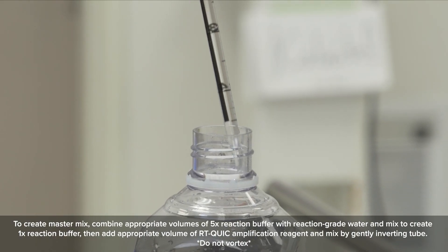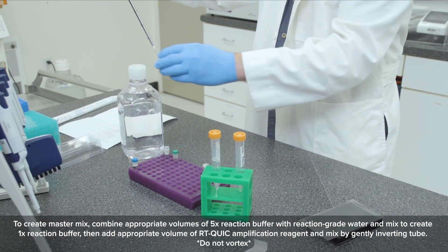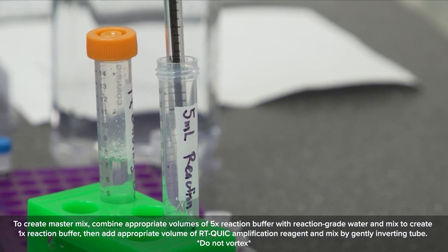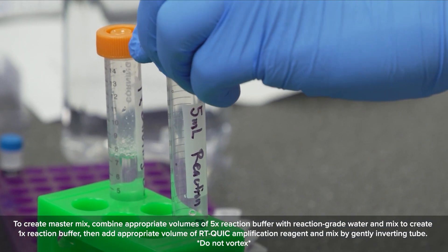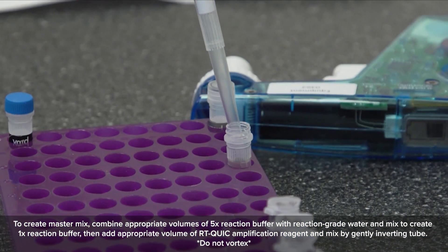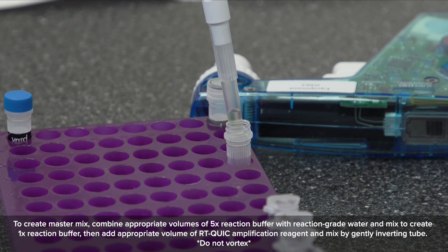To create the master mix, combine appropriate volumes of 5x reaction buffer with reaction grade water and mix to create 1x reaction buffer. Then add the appropriate volume of RT-QUIC amplification reagent and mix by gently inverting the tube. Do not vortex.